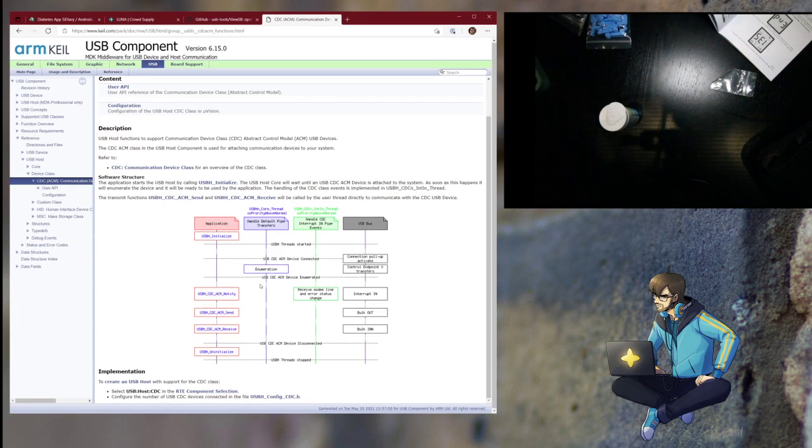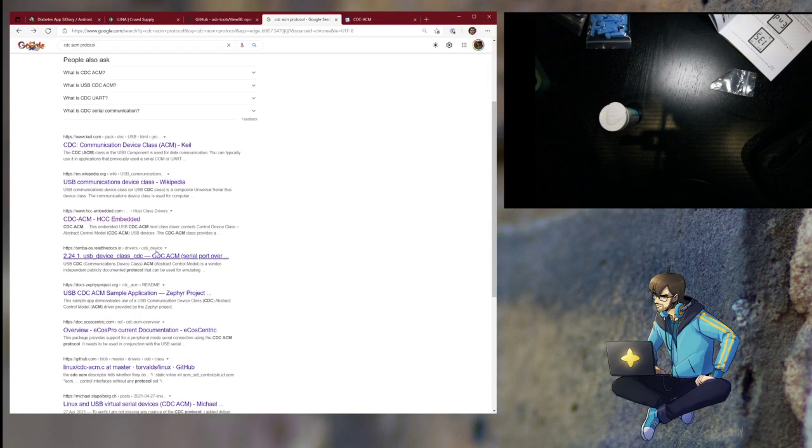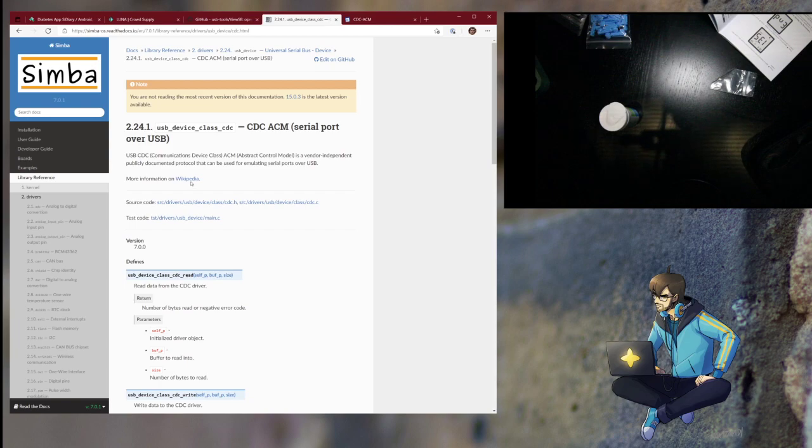That's a lot of information. Yeah, it's a bulk out for send and a bulk in for receive. It's an interrupt in for the notify. And let's see, how's the initialize? That's a user API. I don't want the user API. I actually want the low level. Publicly documented protocol. I'm glad it is.